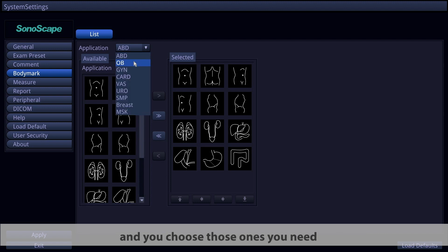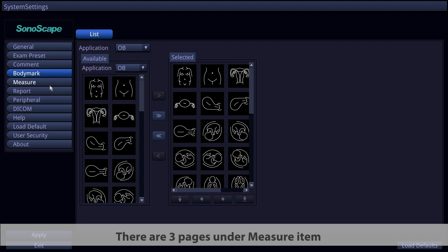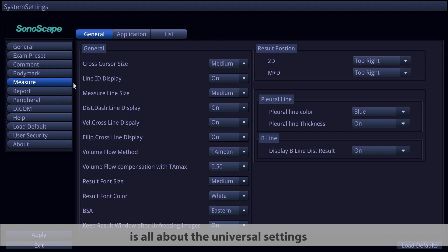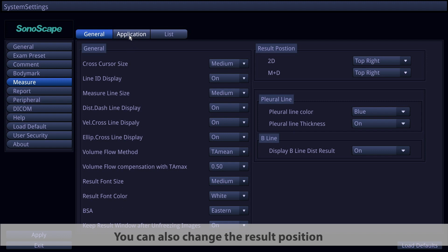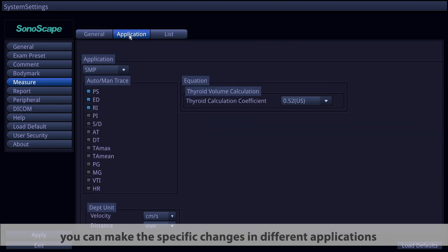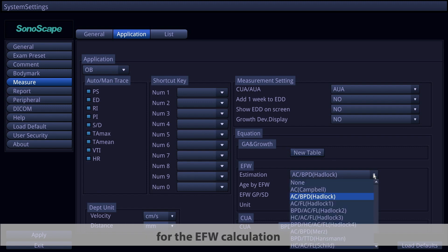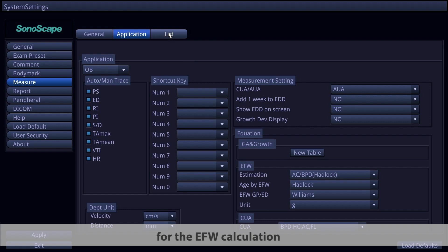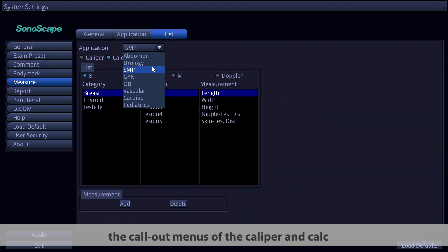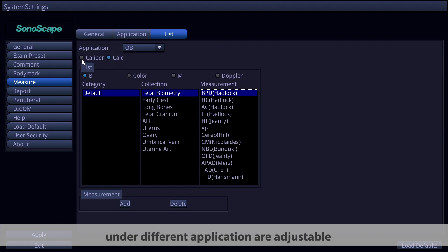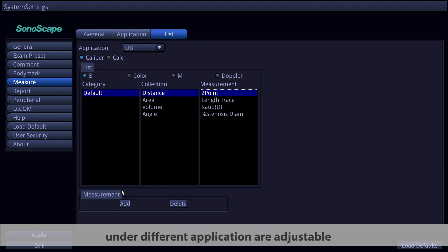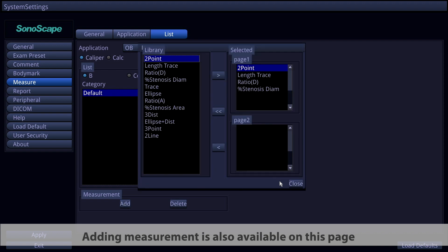Choose the body marks you need. Under the Measure item there are three pages. On the General page, universal settings for measurement elements are configured, and you can change the result position. On the Application page, make specific changes per application — for example, in the OB application you can choose different estimations for EFW calculation. On the List page, caliper and calc call-out menus for different applications are adjustable, and adding measurements is also available.